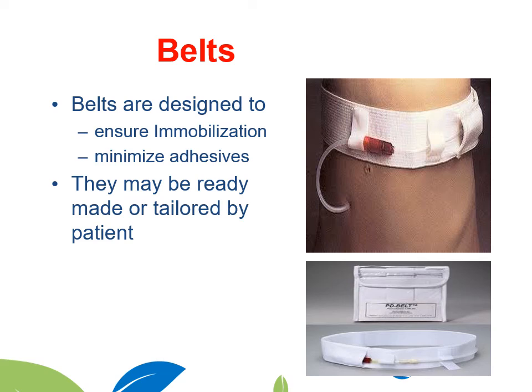We will go for some accessories that are being used. I think you have seen it many times for the PD catheter. You should have some belts for the patient that can be used later on to ensure immobilization and minimize the adhesive that is being used, which causes allergy and skin crusts all around the catheter. Could be ready-made, or it can be tailored for the patient.